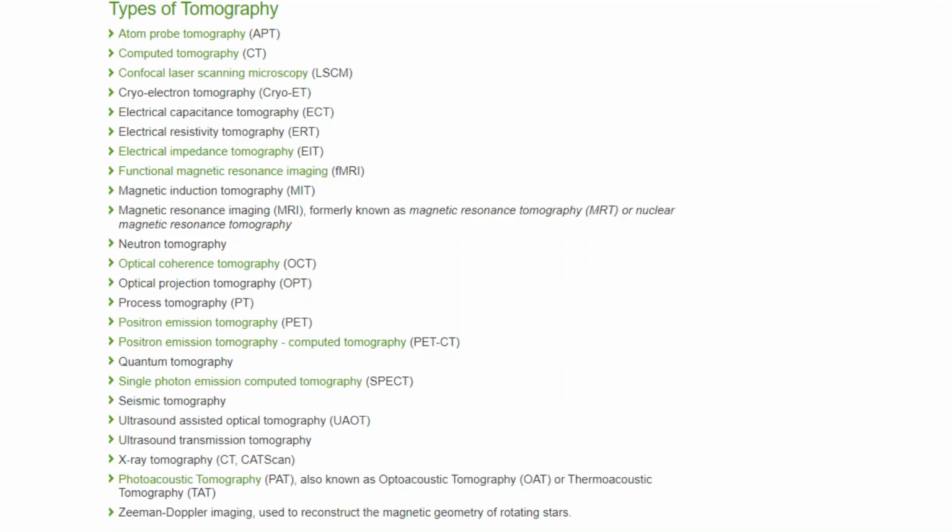Now when you pass an X-ray or any other form of radiation, you won't get an image like you got in an X-ray. The detector captures the radiation and sends it to a computer which decodes it. Hence the name computed. There are multiple types of tomography which use various kinds of sources to get tomograms like visible light, laser scanning, electrical capacitance, X-rays, gamma rays, sonar, ultrasound and positron emission. I won't go into too much detail there, so let's stick to CT first.